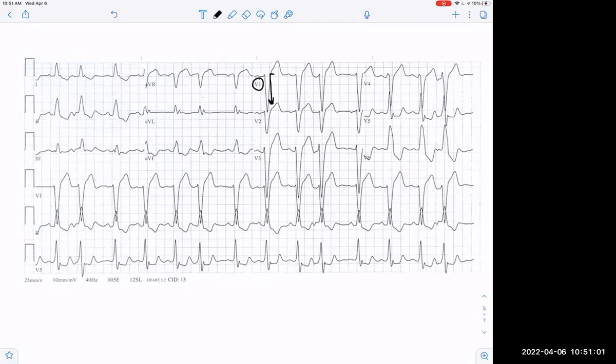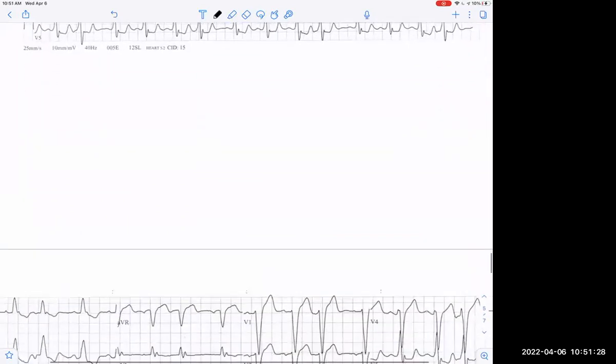So it all depends. We do have left ventricular hypertrophy here and it's fairly advanced, but you have cases, of course, where the disease process has to start somewhere. So it just depends on how soon or how late you catch it in the continuum, and what components you'll have on your EKG. Does that make sense? Did I answer your question? Sure, got it. Thank you. Okay, so let's go to our next practice 12.